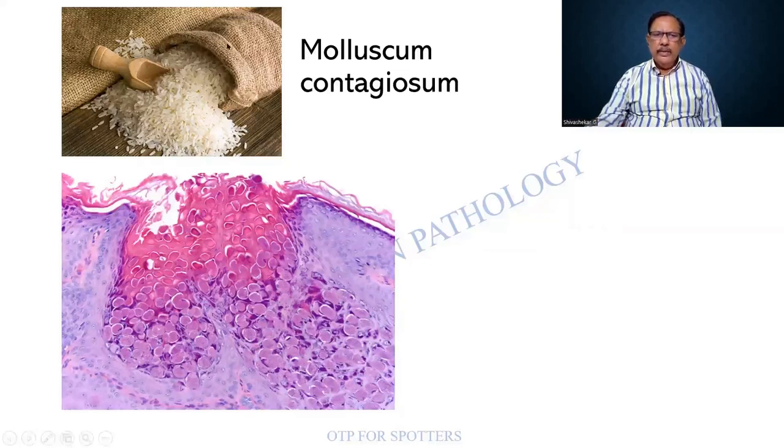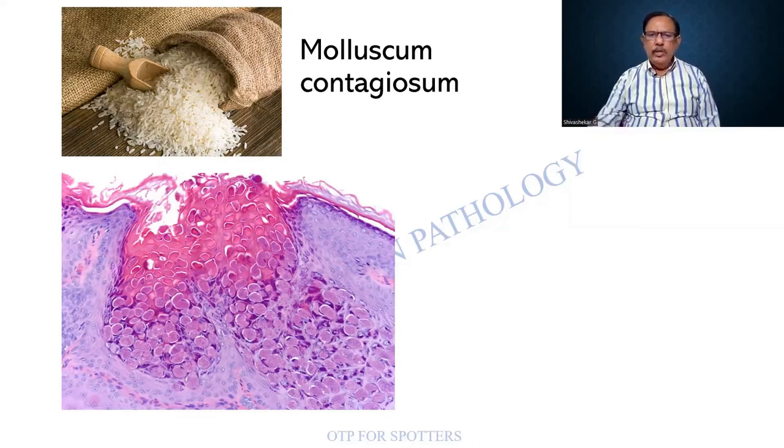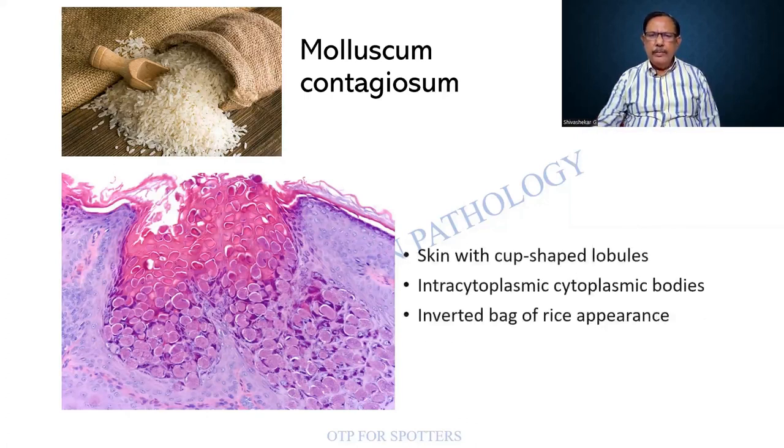What is said is, this is a bag of rice. When you invert the bag of rice, everything seems to be falling down. Similarly here, from the epidermis, there are the cells which are getting denuded and they fall off. So it has got an inverted bag of rice appearance.